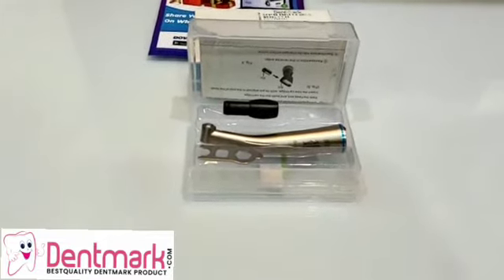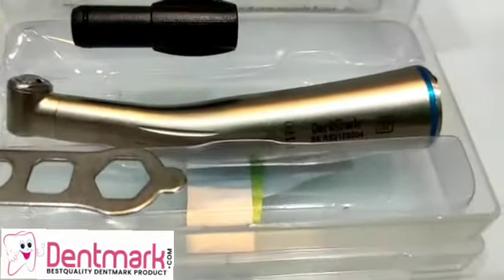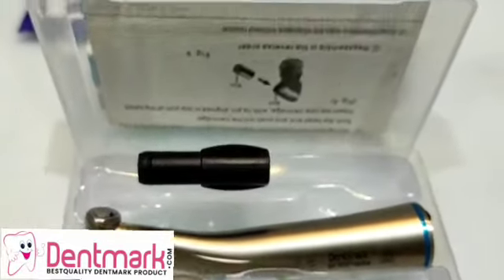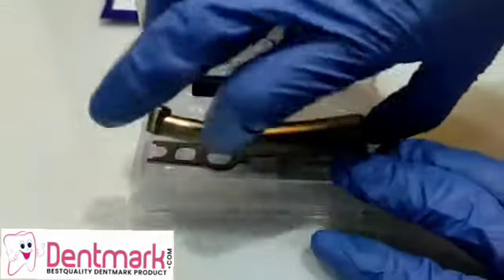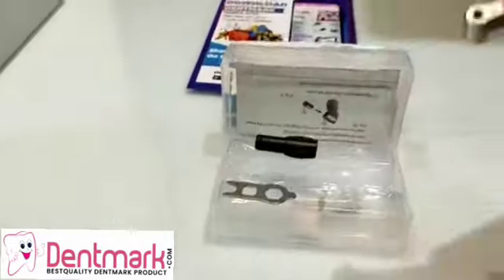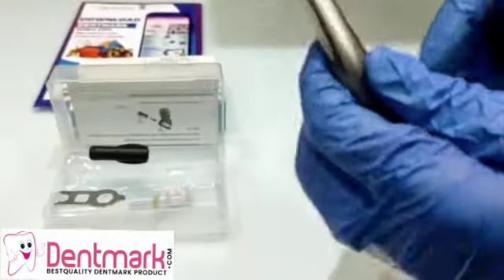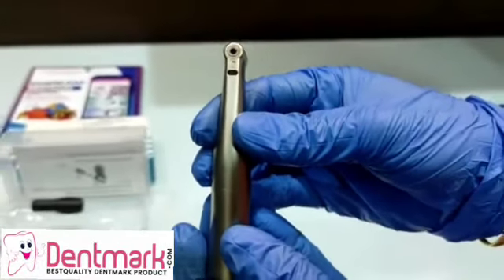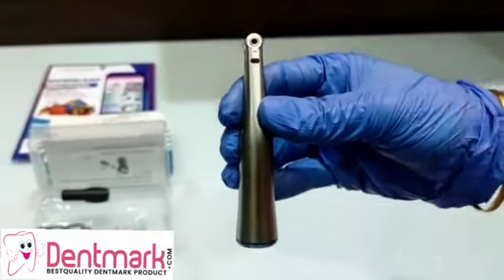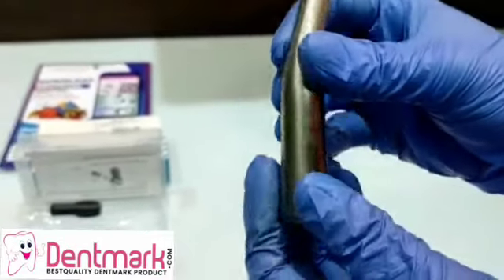Greeting Denmark viewers. Today we are going to watch a video on the one-is-to-one electric handpiece by Denmark. This is a very unique handpiece which is not air driven but used with an electric motor. This is an electric push button fiber optic contra angle handpiece. Firstly, the gear ratio is one-is-to-one.